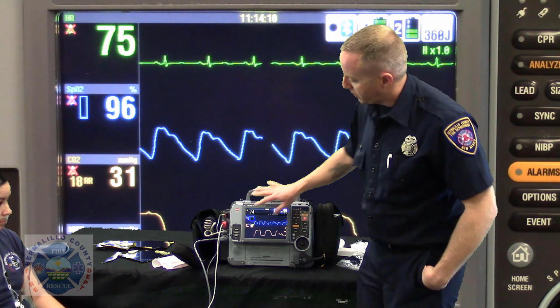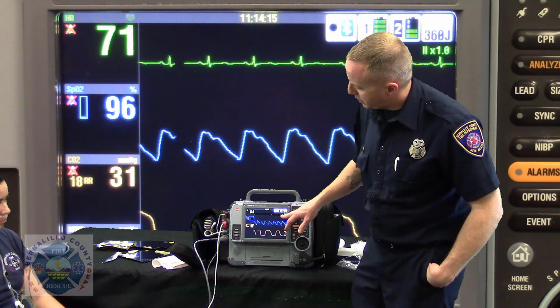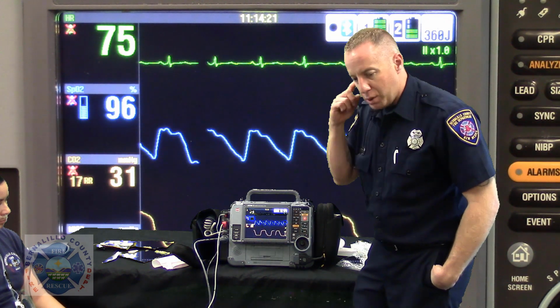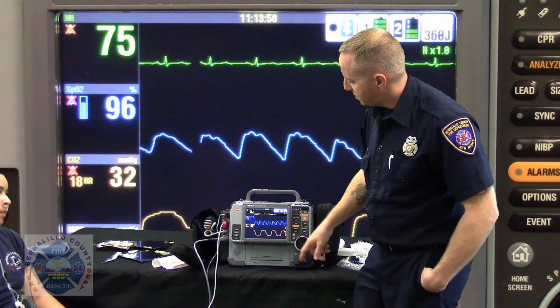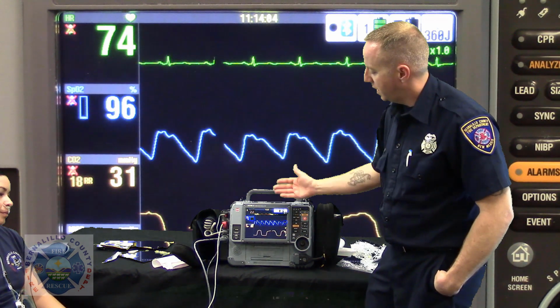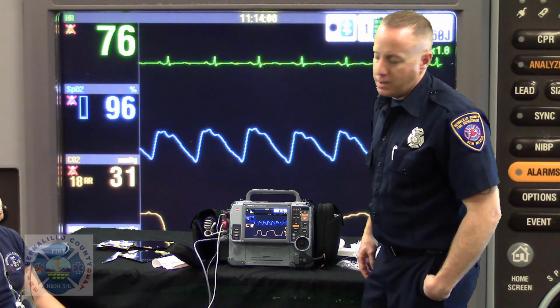And you see this beautiful clinical picture that I have now. I have a good monitoring of lead 2 and the EKG. I have a plethysmograph reading for blood flow to the fingertip with a pulse oximeter and an audible pulse to listen to that I have mechanical heart activity. And I'm watching the patient's respiratory status very, very closely. All of this in a matter of moments as I started my clinical assessment.